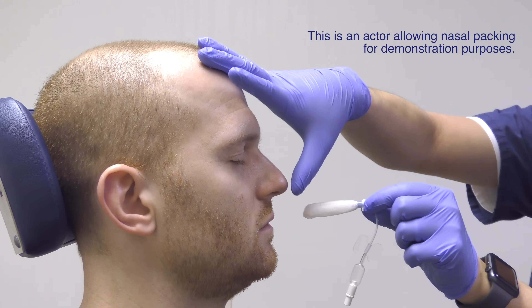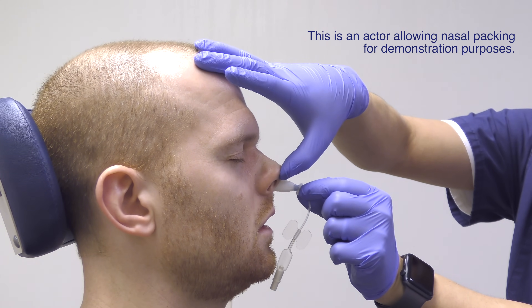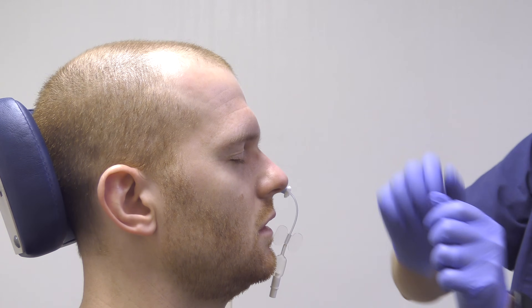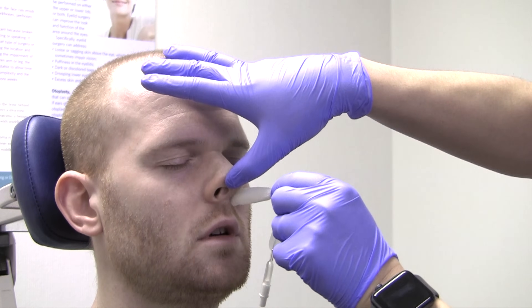After hydration, the nasal packing is slowly inserted through the nostril where the nosebleed is occurring. Here is the nasal packing demonstrated again from a different angle.